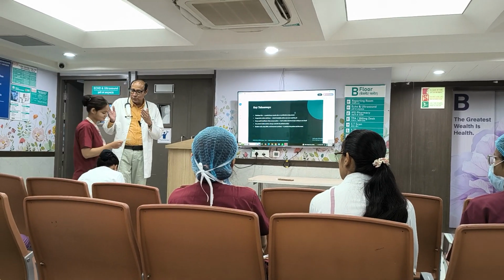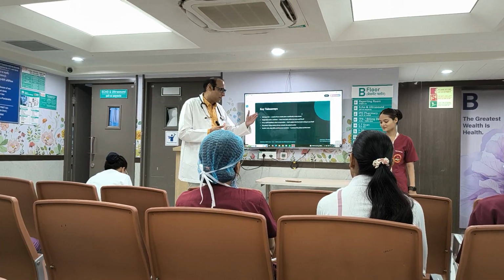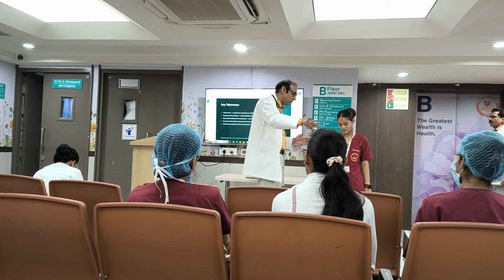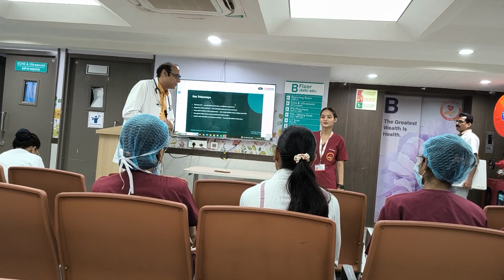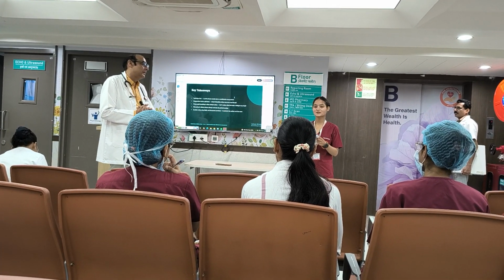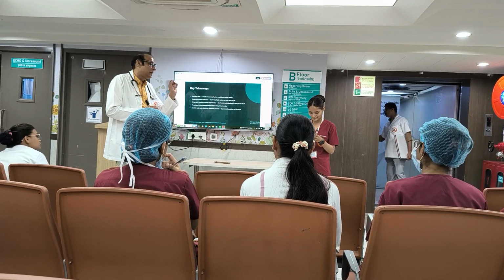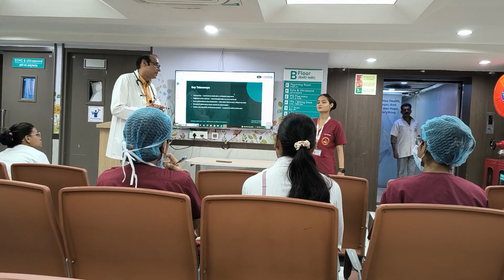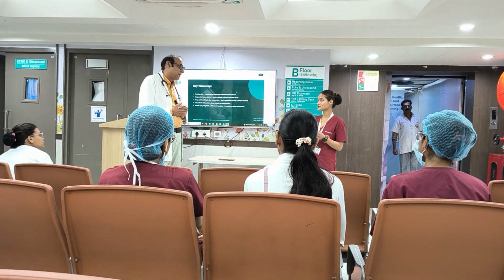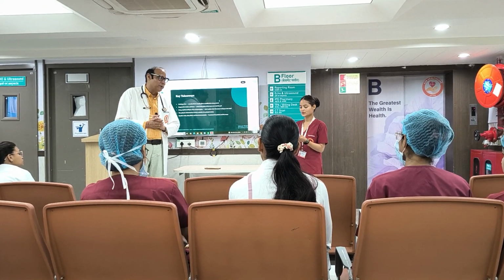First you introduce yourself: who you are and what you are doing, and the ABG number. First you tell about yourself and then you go. Good morning, everyone. My name is Anita. Now I'm reading the ABG sample. So basically, ABG is arterial blood gas. What is the difference between ABG and VBG? ABG is used for measuring oxygen, and VBG for the metabolic component, through bicarbonate.